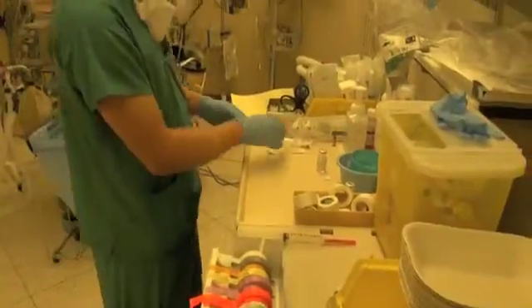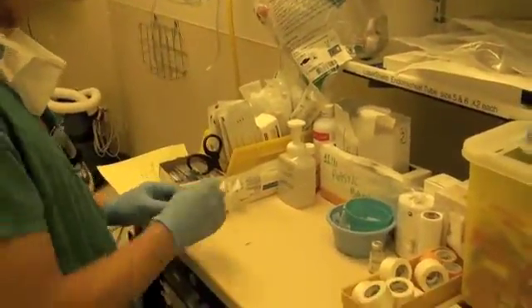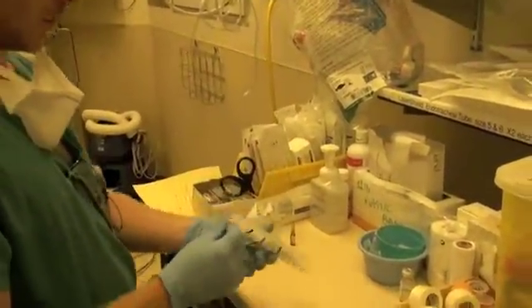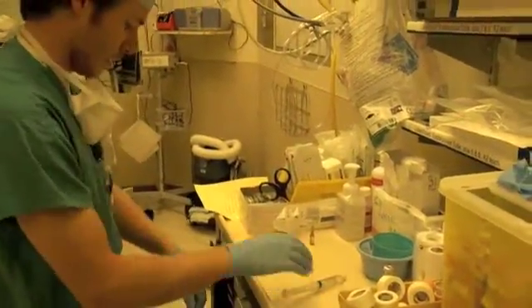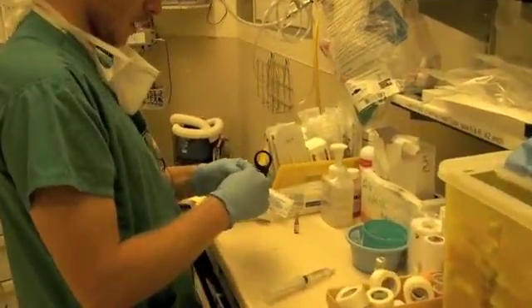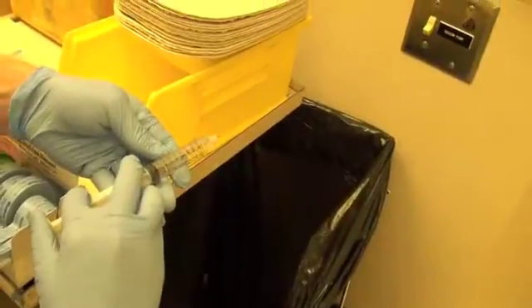So that's two techniques we've demonstrated. The third technique we're going to demonstrate today is diluting 50 milligrams per milliliter of ephedrine one in ten. We're going to get one of the preloaded syringes — this is preloaded with 10 milliliters of normal saline. To make a one-in-ten dilution, we need to first get rid of one milliliter of normal saline. We'll just get rid of the first milliliter of normal saline into the garbage, then attach our needle.